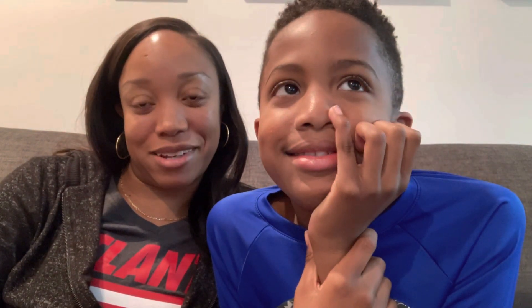Hey, everyone. So today we're here to talk about Jay, who is getting some orthodontic work done. So Jay, tell us what is in your mouth right now.